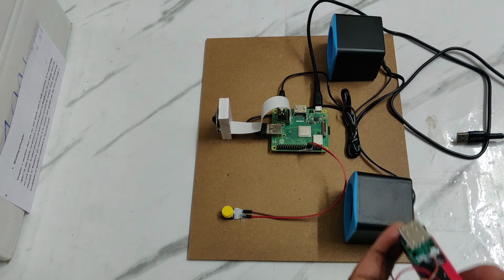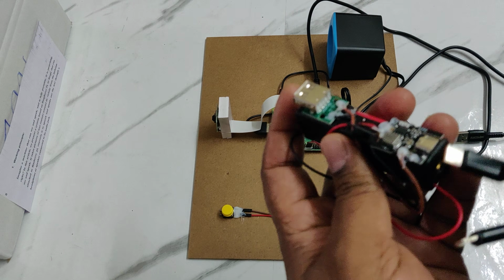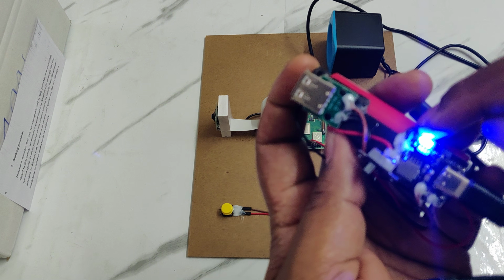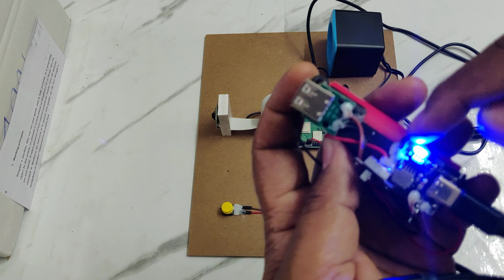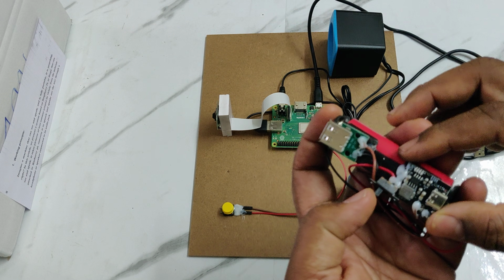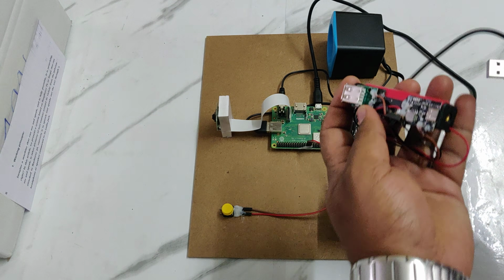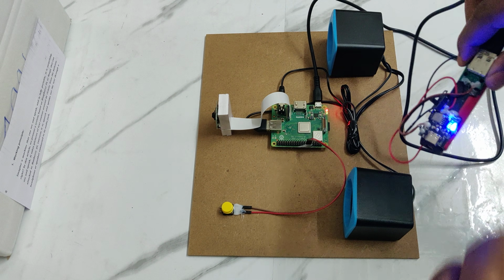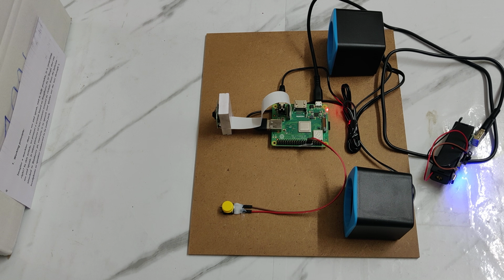Before the demonstration, first of all, keep the battery under charging. For that, just connect this C type cable here, and the light will indicate charging; keep the battery charging until the last light stops blinking. There are four levels of battery indication in total. After the battery is fully charged, first switch this on. This is the on off switch, and connect this at the USB slot. Now you can see the light getting switched on, and now wait till the welcome message is announced.